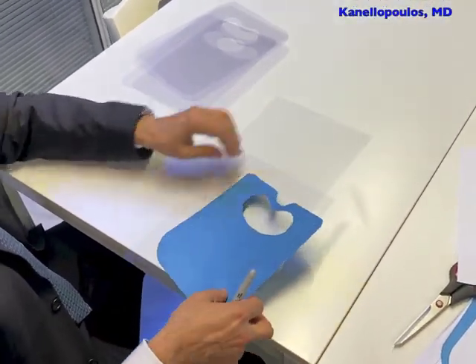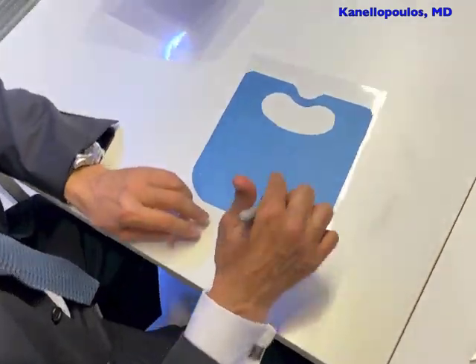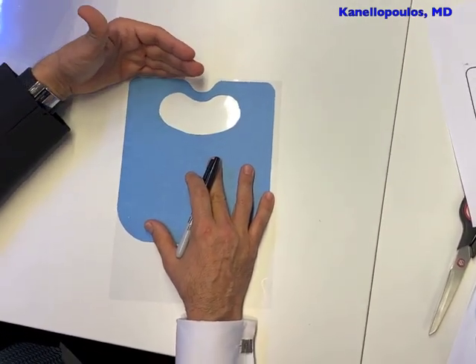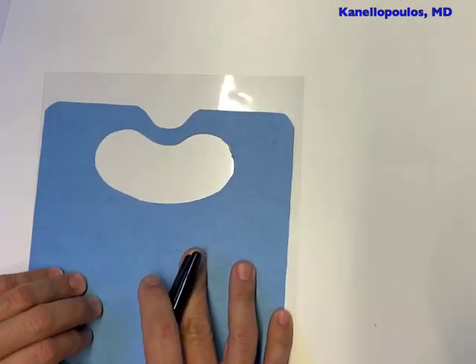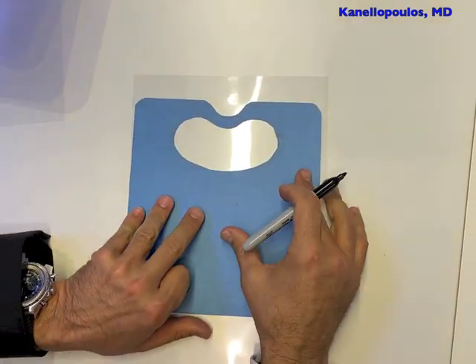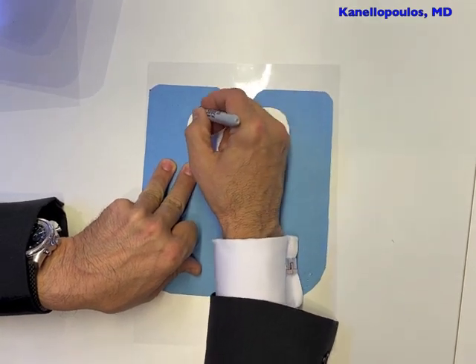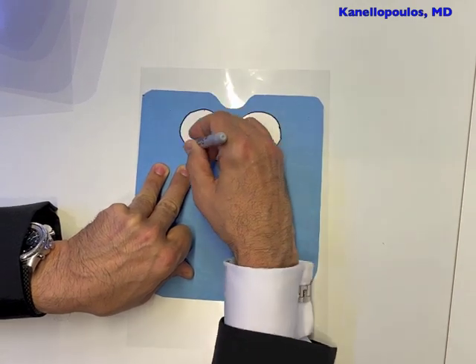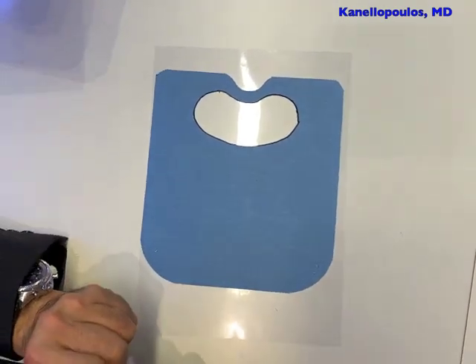This is as simple as taking your cellophane letter size sheet, and instead of going right at the edge of your sheet — in order to create a better shield for your eyes — we're going one inch lower. We're going to use a sharpie marker and delineate just this. That's all you need to do. And this is obviously the space where the oculars from your slit lamp or your surgical microscope will enter.